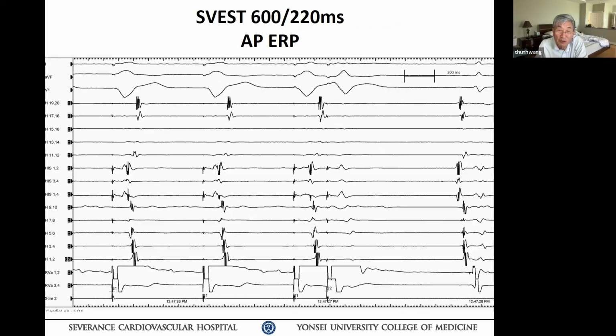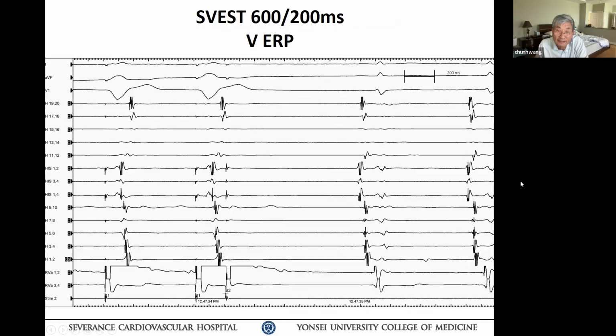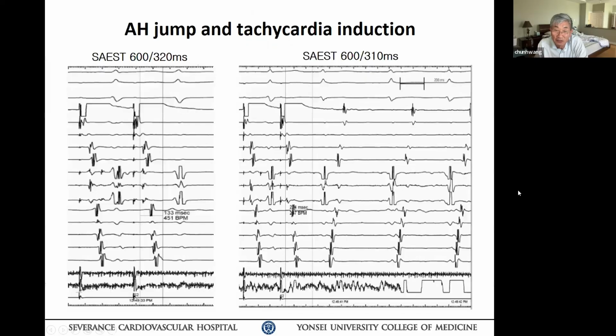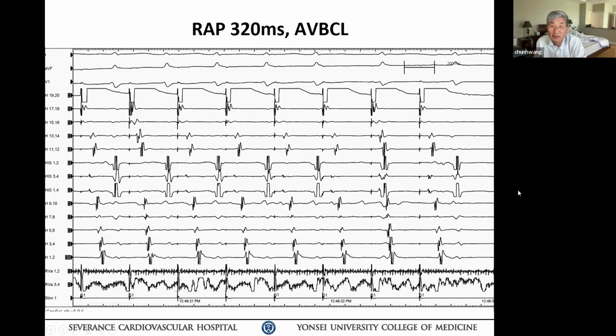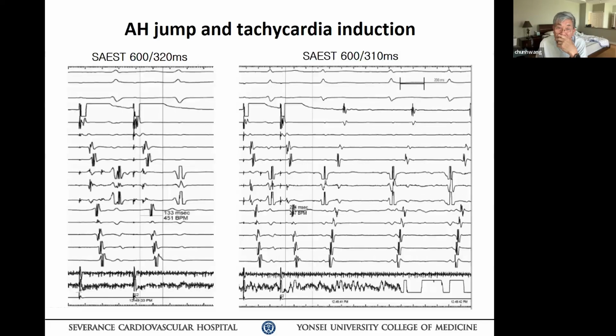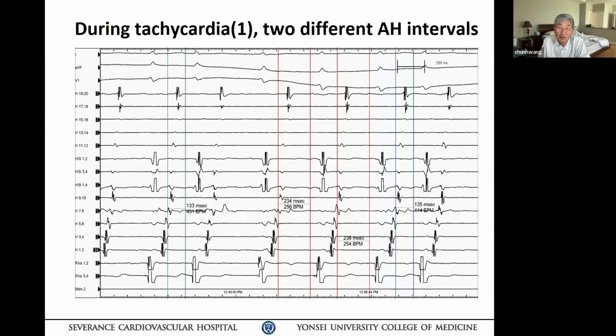I have one quick question there, one more slide there. Keep going. Okay, let's see. No, not this one. I think you showed it earlier, maybe. Yeah, this is the AV node Wenckebach pattern. Okay, keep going. You had a lot of slides. Okay, this one. No, go back there.